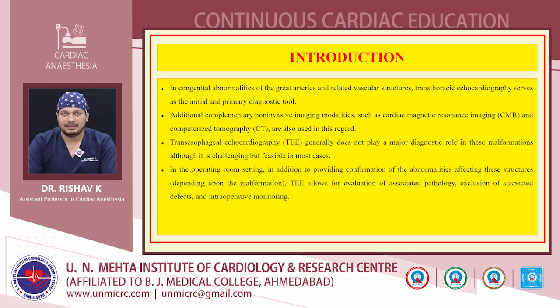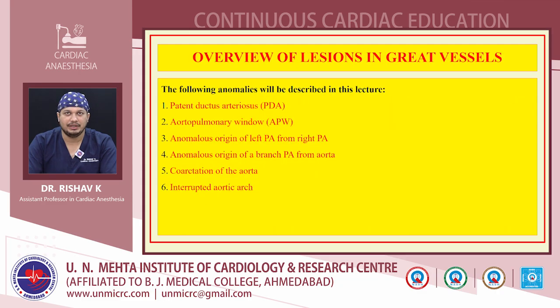As such, transesophageal echocardiography does not play a major diagnostic role, but it is feasible although challenging. However, whenever these patients are put up for surgery, we can use transesophageal echocardiography for evaluation of the associated pathology, exclusion of suspected defects, and for intraoperative monitoring. So these are the lesions in the great vessels that deserve discussion in my lecture today.